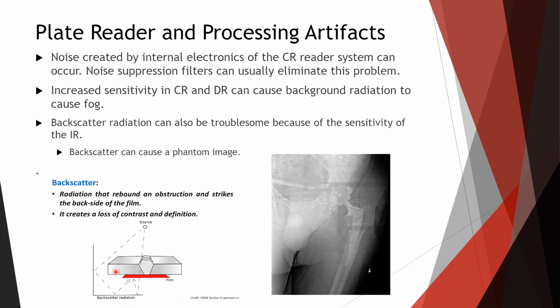Okay, the TFTs inside, they pick up the radiation from both ways. Okay, sometimes with the way that they manufacture, there's a backing plate of aluminum, or it could be some other material, to prevent this. And this could be in the IR, and it could also be in the PSP.